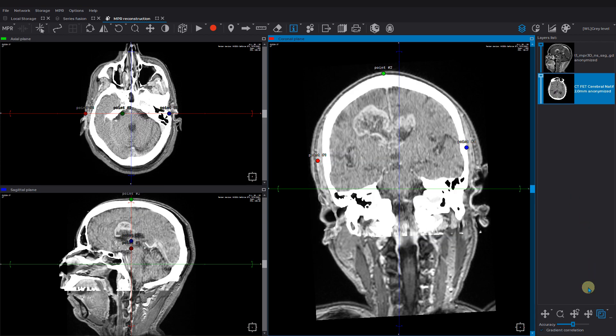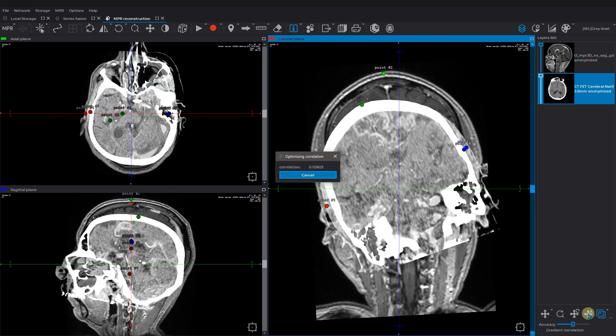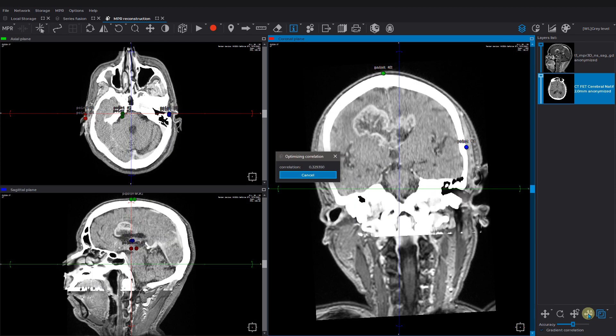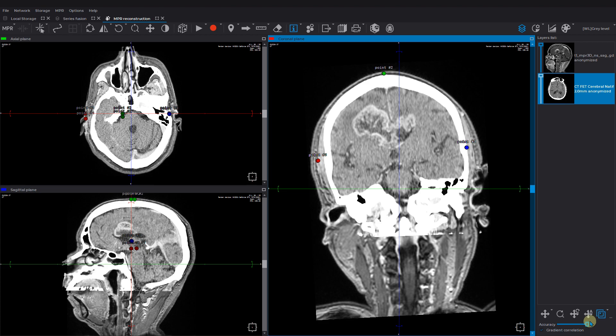Let's switch to the next fusion tool called merge layers automatically. Just activate the function and hold on until the registration process is done. To adjust precision of the automatic merge, use the accuracy slider.